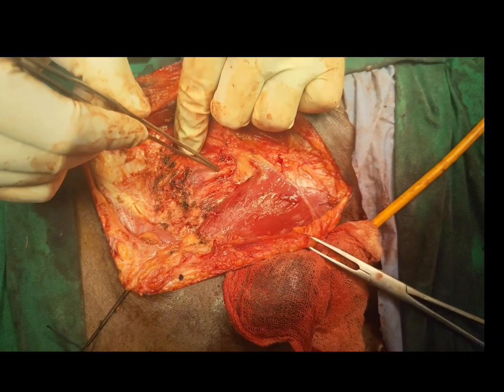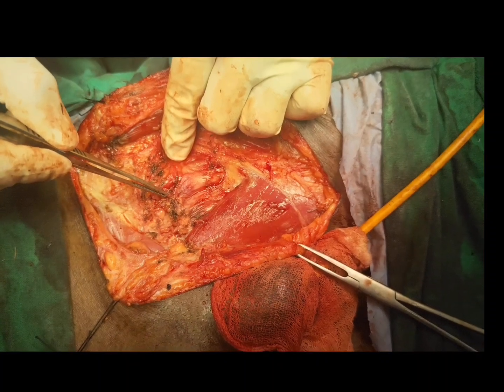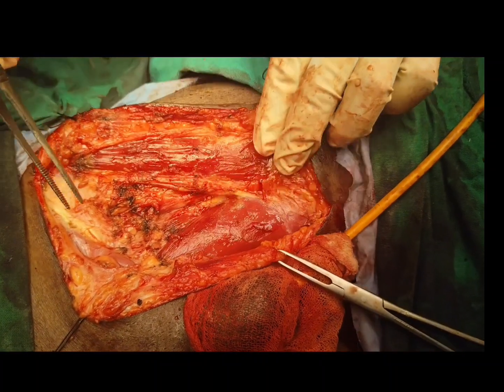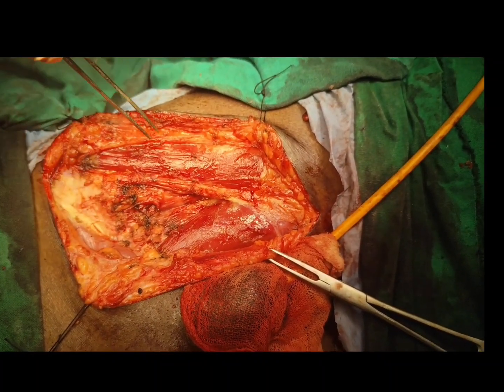Following that, you have seen the great saphenous vein, the femoral vein, and we have done the flush ligation of the great saphenous vein at the saphenofemoral junction. That is the proximal part, and this is the distal part. So we have cleared the left inguinal lymph nodes.